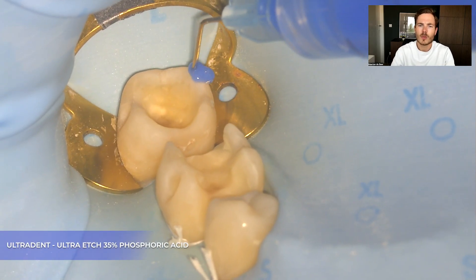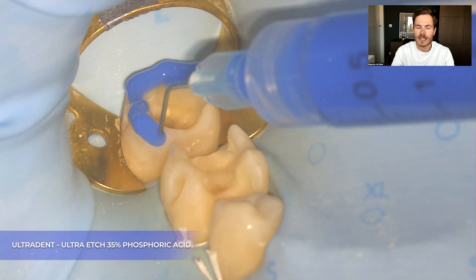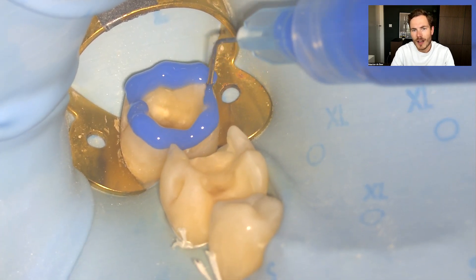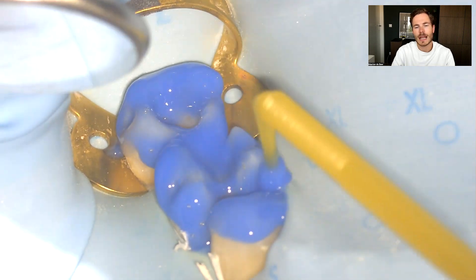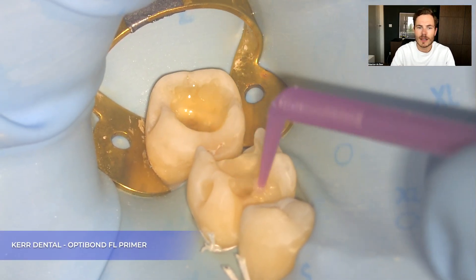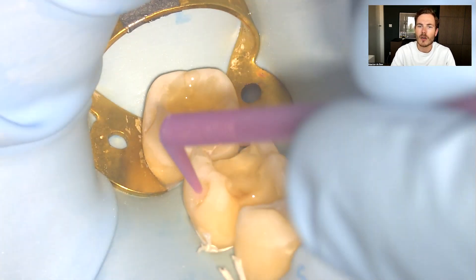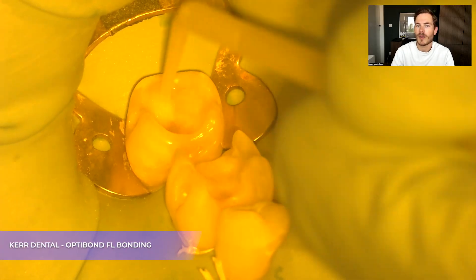After all the teeth are prepared, we now start with applying the phosphoric acid. In this case I use a 35% phosphoric acid by Ultradent. I make sure to apply it on the enamel first, since this will need a longer etching than the dentin. Then I will apply the OptiBond FL primer by Kerr Dental, followed by the OptiBond FL bonding.